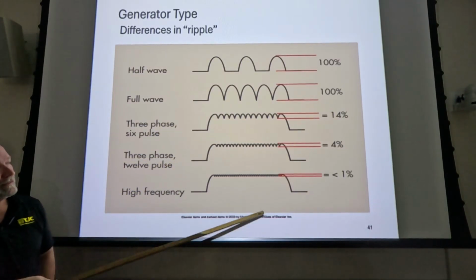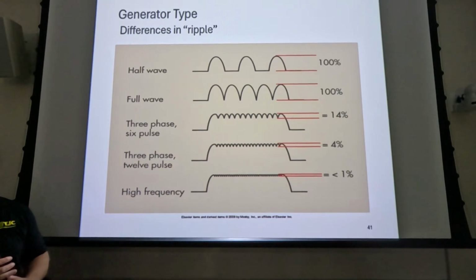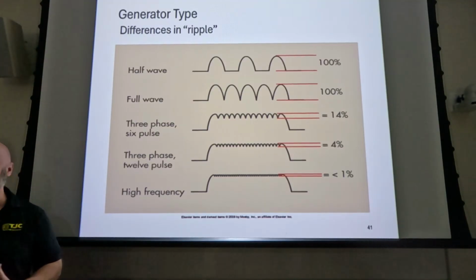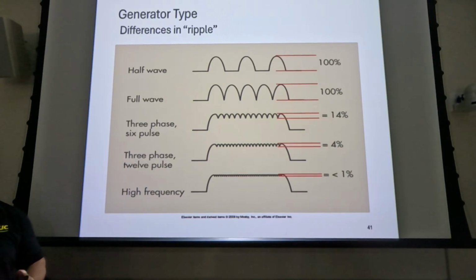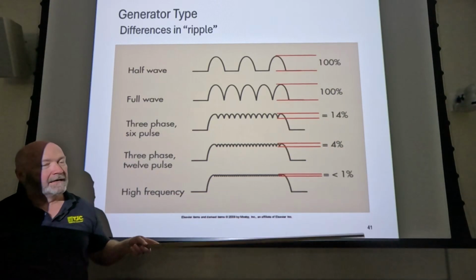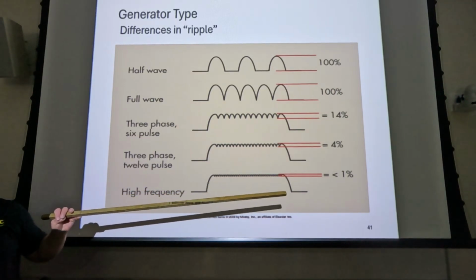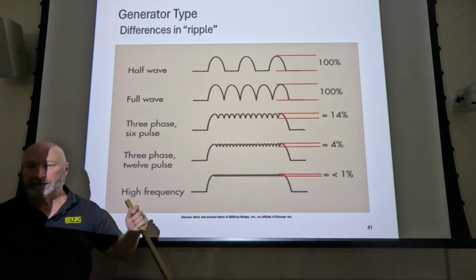Right? So in these three, where does your voltage drop to 0? When you stop making an exposure, right? So it doesn't, right? So if the voltage never drops to 0, then this voltage ripple indicates the peak to the minimum voltages, right? So now, let's say you've got a whole semester's worth of tests, and the only test scores that you have are 100 and an 86. What's your average?